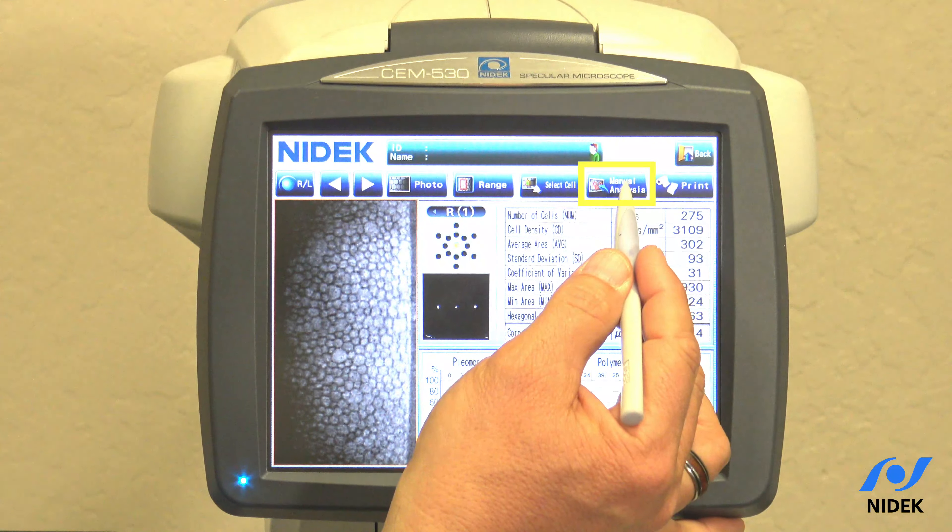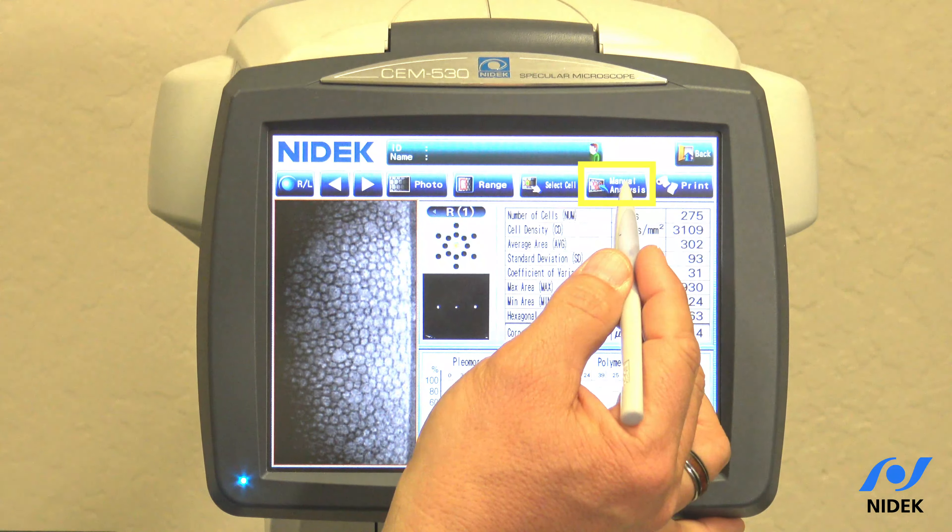As you can see here I have 13 cells. They won't show up on photo; however, if I go into apex you can actually see where I counted the cells.